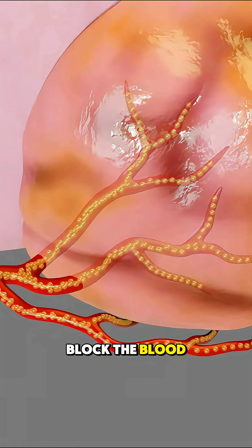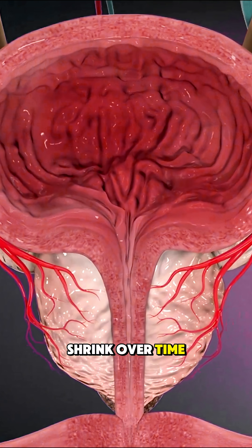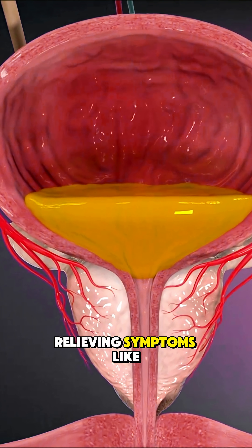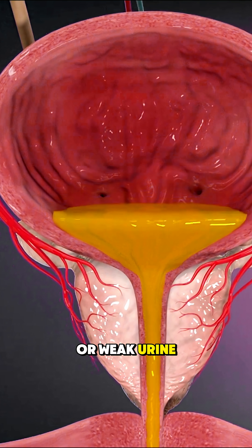These particles block the blood flow to certain parts of the prostate, causing it to shrink over time. This reduces pressure on the urethra, relieving symptoms like frequent urination or weak urine flow.